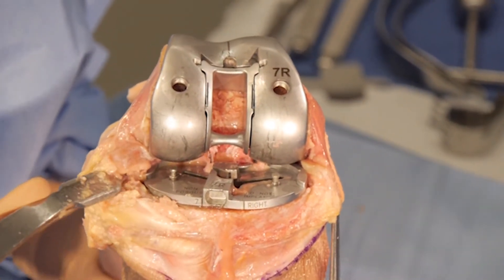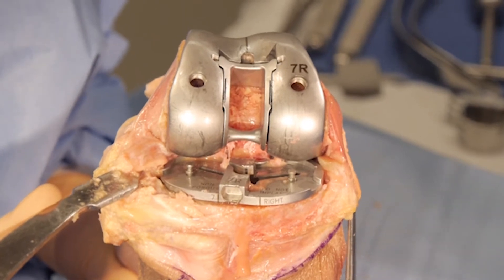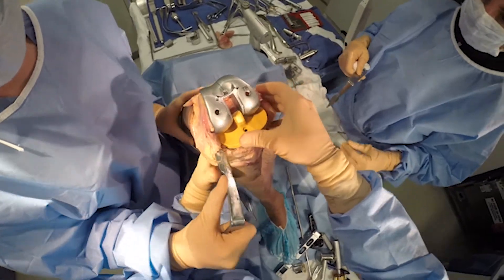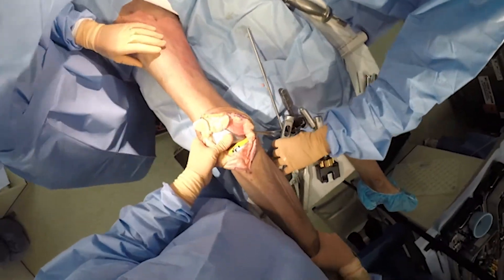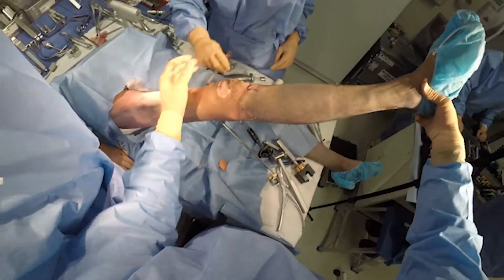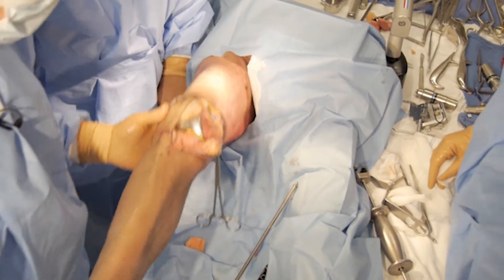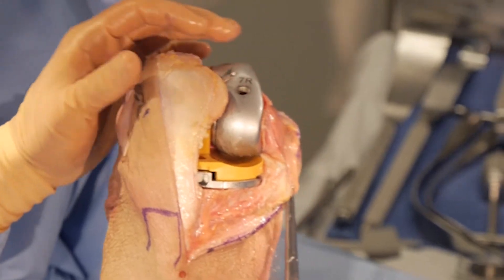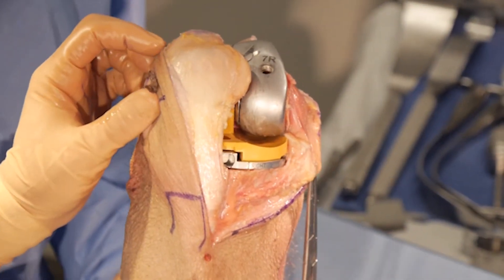Now I'm ready to insert my trial insert, starting with the smallest polyethylene that will give me good stability. A lot of times you have to bring the knee into extension to get it to click into place. I've got full extension. When I flex the knee up, we've got great flexion and the patella is tracking well without any patellar component — so with the patellar component it will track even better.